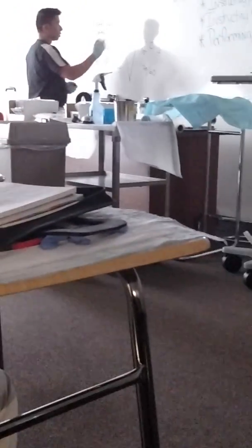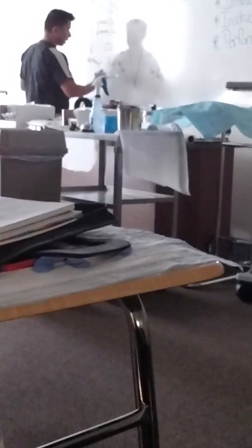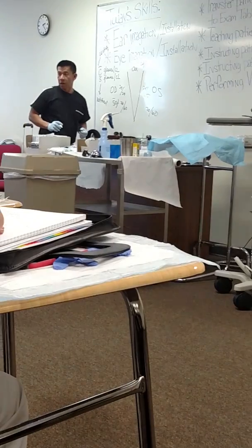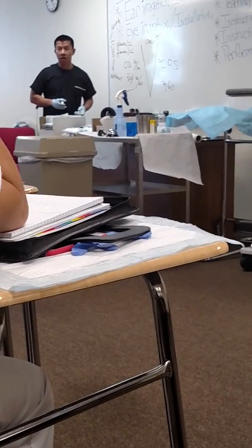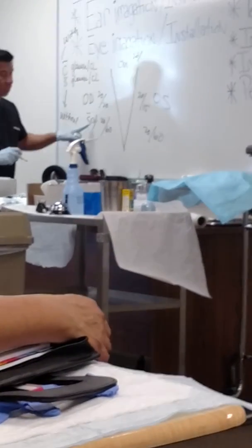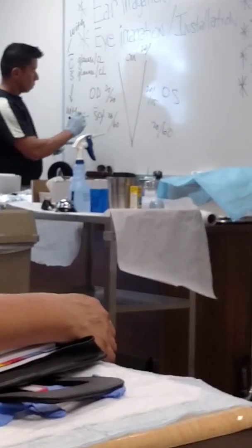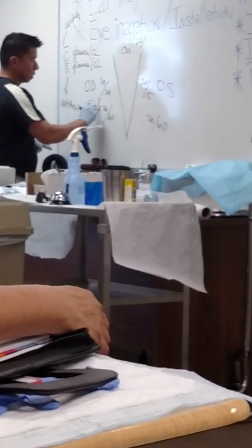So with glasses, what is this reading? 20/15? Both eyes, yes? Are you guys with me? Yeah. Okay. You're not following me? Okay. That measure of the 60. Okay, 20/60 is without the glasses with no pinholes.